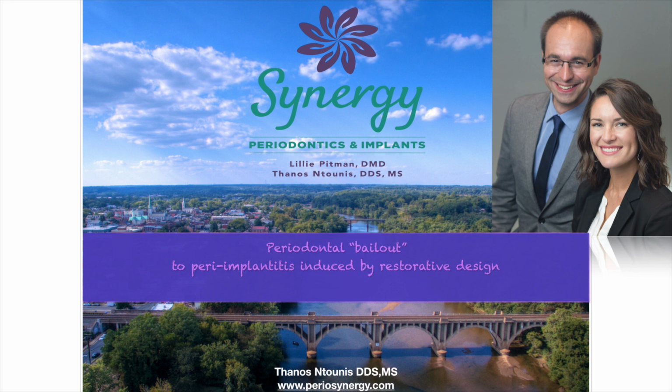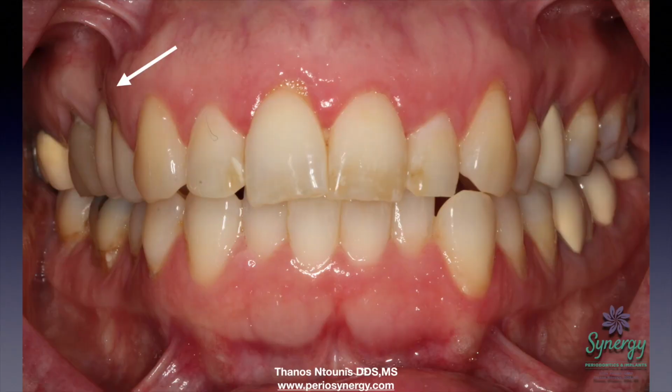Our practice is Synergy Periodontics and Implants, and I'd like to present to you a simple periodontal bailout to a peri-implantitis lesion induced by restorative design. Many times we get referrals that have to deal with older restorations on implants, older implants, and the concern is, can we do anything to save that implant, or can we do anything to allow for a better environment around that implant?